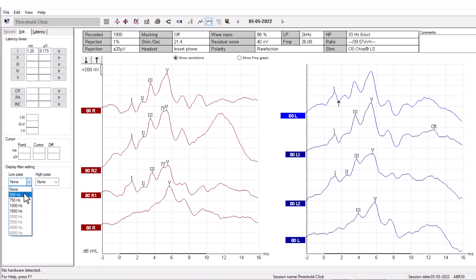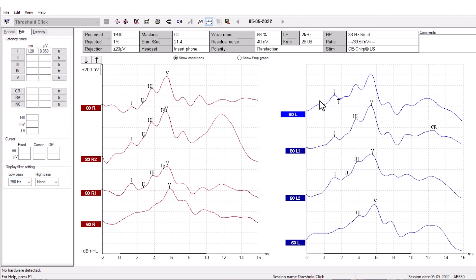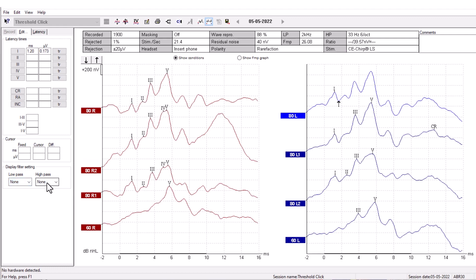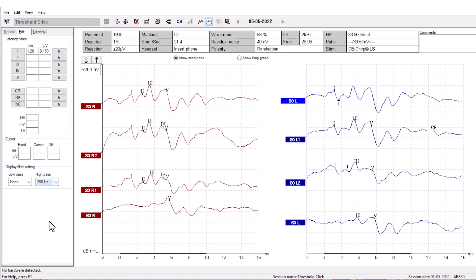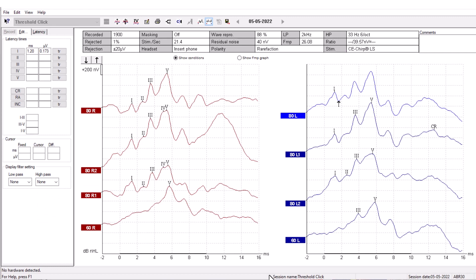For example, using the low-pass filter will typically smooth the curve, and using the high-pass filter will reduce the low-frequency content of the waveform, as seen here. As you can see, a lot of the low frequencies have been removed by setting the high-pass filter at 250 Hz.